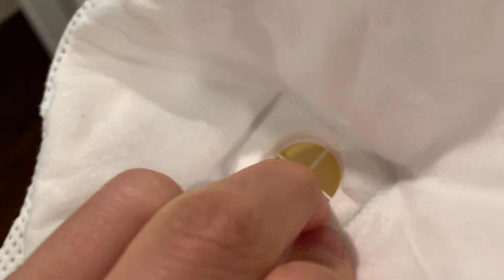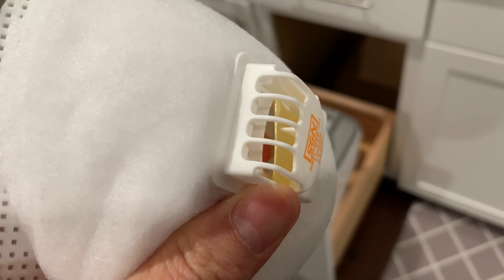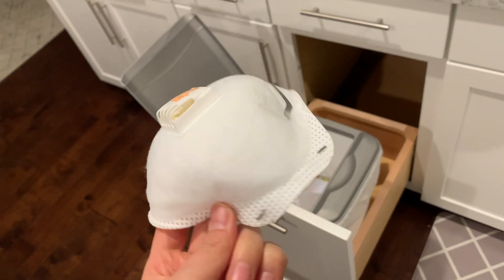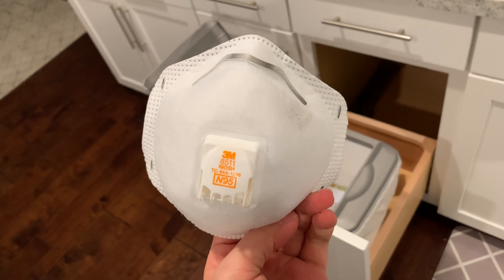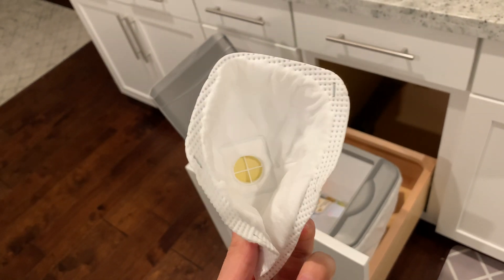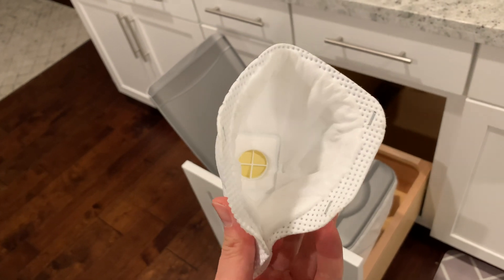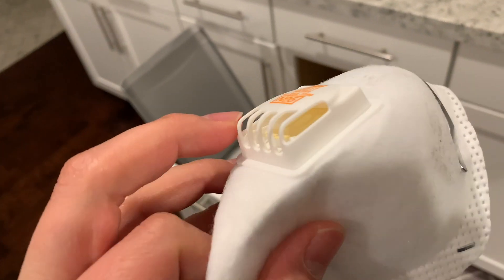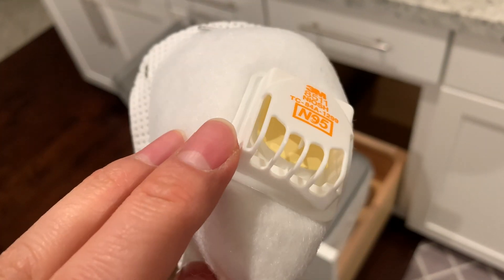It's a very simple mechanism. Looks like it has a little bit of flow. Not sure if that was already taken into consideration. So anyways, be careful out there and wear the mask. Make sure the seal is good — make sure there's no gap if you're buying this version.